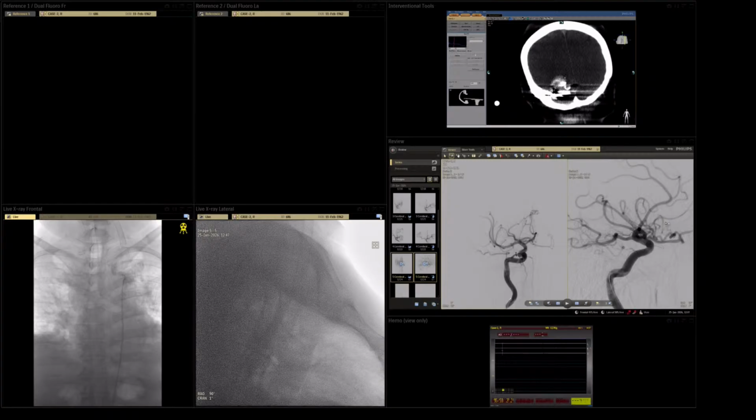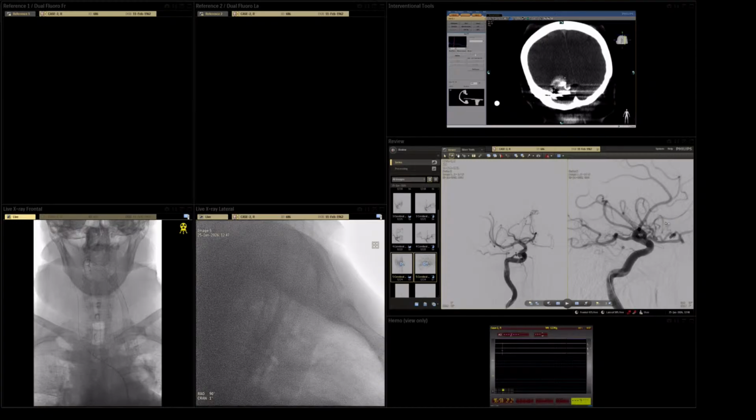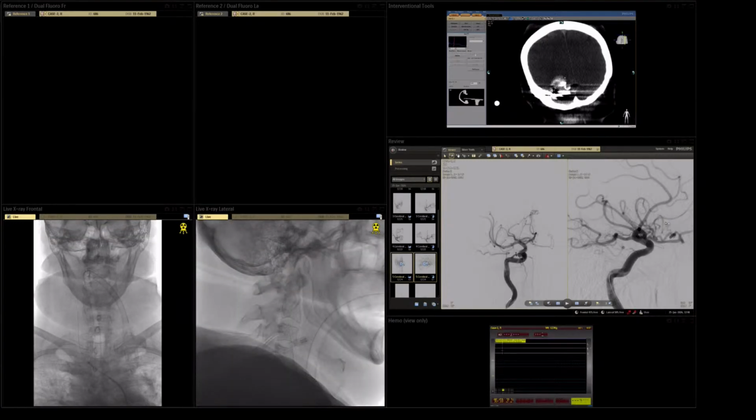Now I have a Neuromax, and inside the Neuromax we have a 6 French coronary guiding, which is Hyperion. Hyperion is an Asahi guiding catheter. That's what I say. Need to go to the ICA territory.